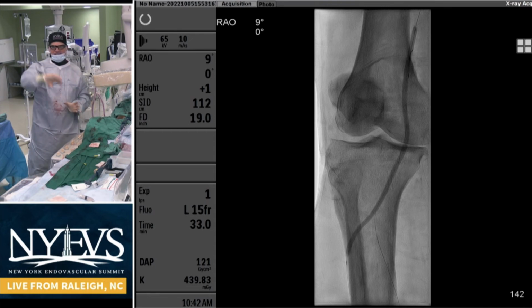In terms of the stenting of the popliteal, absolutely. Supera probably has the best evidence, the best radial strength, best flexibility. And then when you get above that, if we need another one, I would probably use a drug-eluting stent, just because of the calcium. We'll see how much; you may use two Superas, depending on how much calcium you have. But that's my strategy. Excellent.